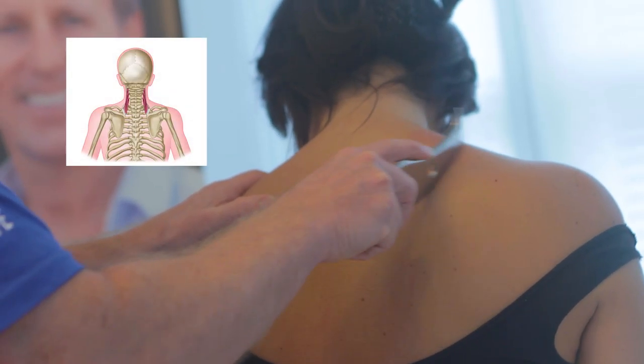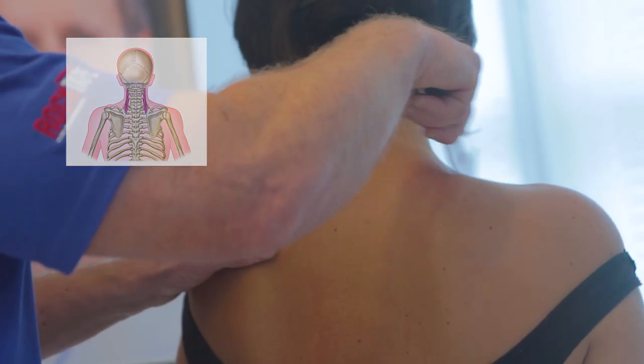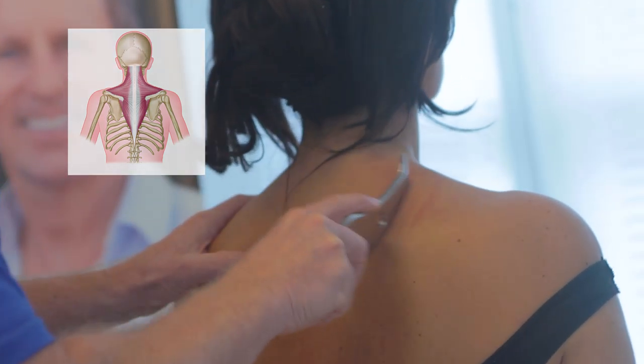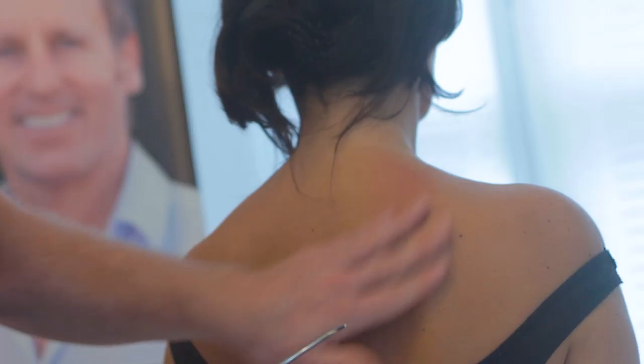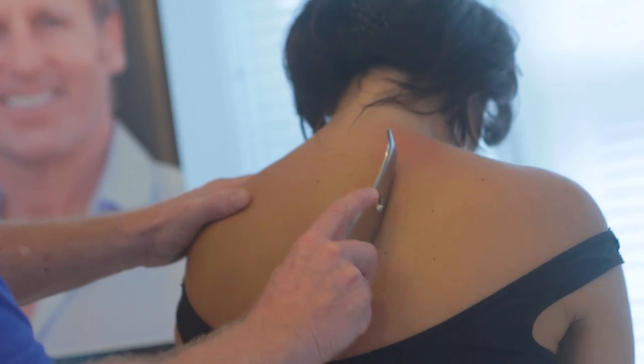So just be a little bit careful on pressure. When you're ready, off you go — this is working around the levator, so we can just glide through that pressure. You can work into the trapezius, covering quite a lot of the tissues as we come through. If you feel you get a bit of friction, just apply a little bit more wax to that area and then you can just glide through.